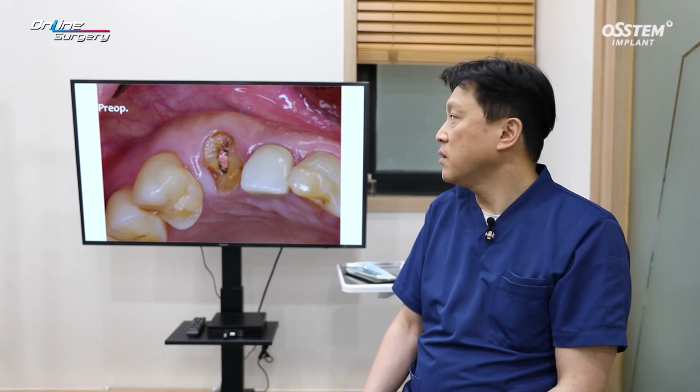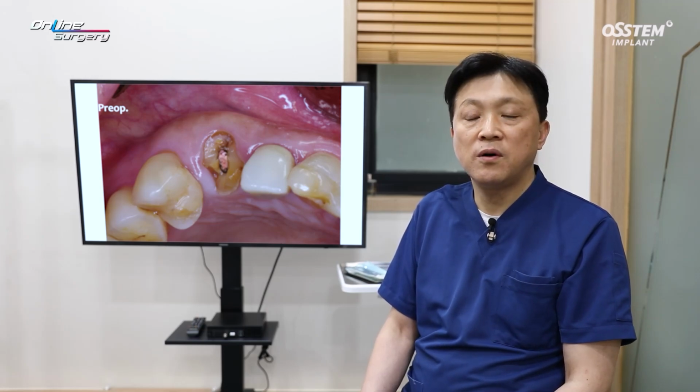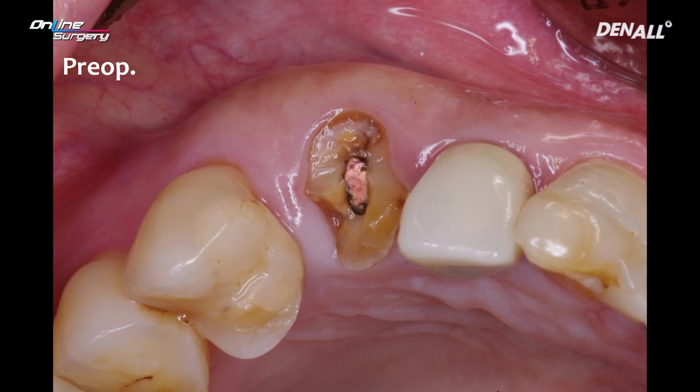Today, I want to share with you a case in online surgery lecture. In number 13, there was crown root fracture requiring immediate implant placement. If you look at the intraoral image pre-op, the patient received the crown before, and the crown was fractured.